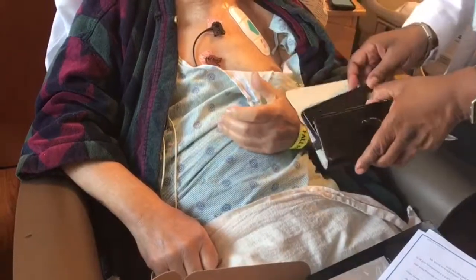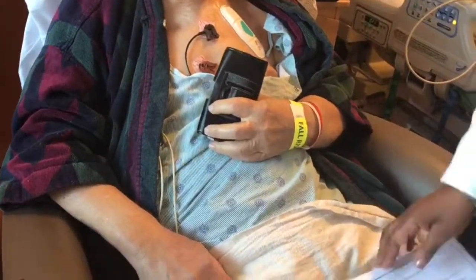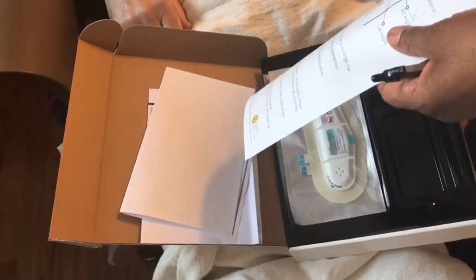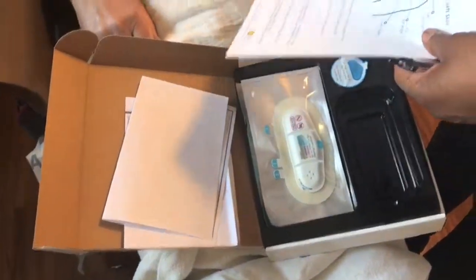We can put that in there for you — your new best friend for the next two weeks. Remember to bring this with you to the doctor's office so that they can put the patch on. In case there's not good connectivity, it will beep — and apparently it's annoying enough to keep you awake. If it's the day before your appointment, don't worry too much about it, but instructions are here on how to replace the patch.